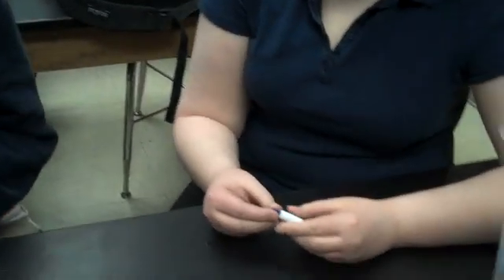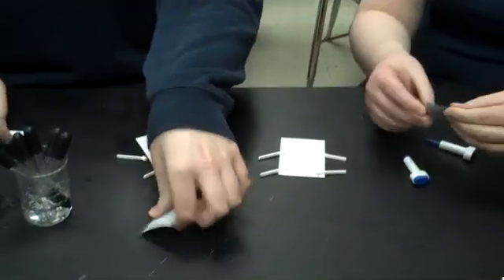Now we need to use the lancets to prick their finger to get a sample of blood. First, clean your finger with the alcohol prep pads.